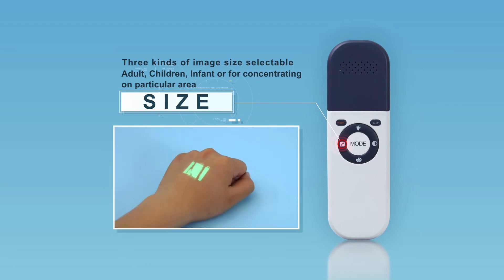Three kinds of image size are available to suit adults, children, and infants. They are also helpful when medical staff need to focus on a particular area. The size can be changed by short pressing the size button.